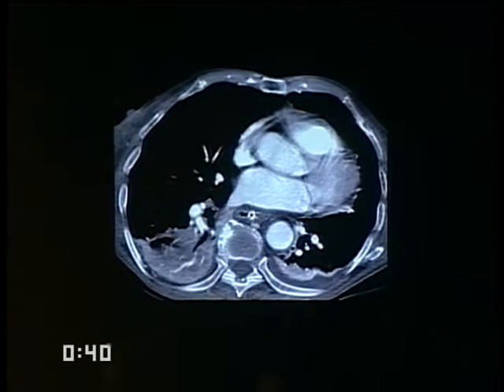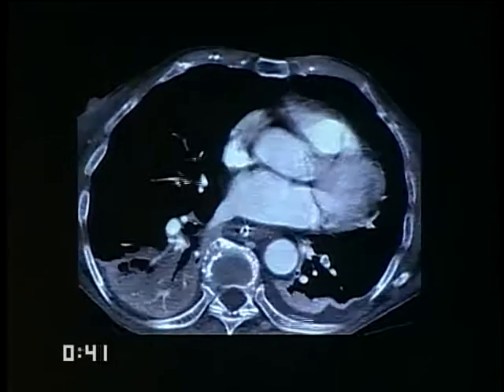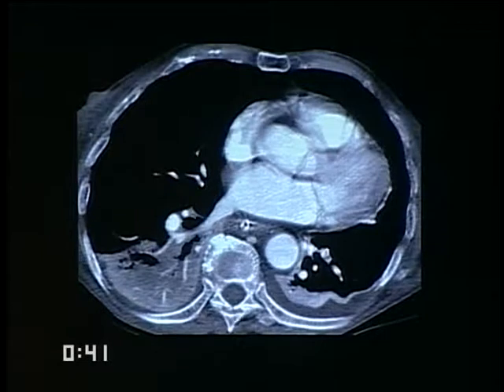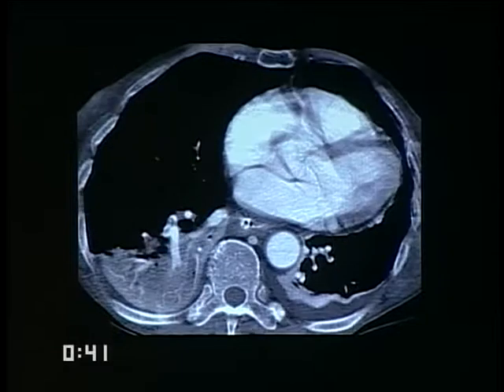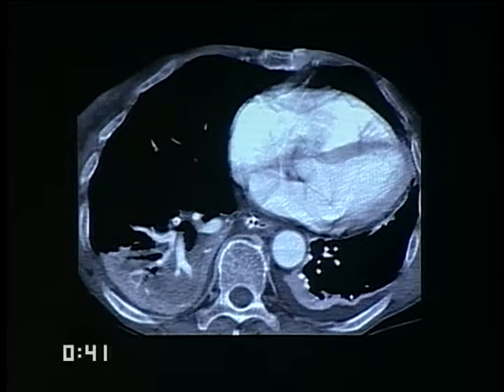In patients who have a lot of disease and consolidation, as shown here, it can be more difficult, though we can on occasion pick up small emboli even in these distal consolidated and collapsed areas in the lung bases. So notice that in this particular case we're picking up a filling defect here in the descending pulmonary artery. Here it's extending, a little serpiginous thrombus extending over the bifurcation. Here it's now in both branches, and as we go down distally we see it further.